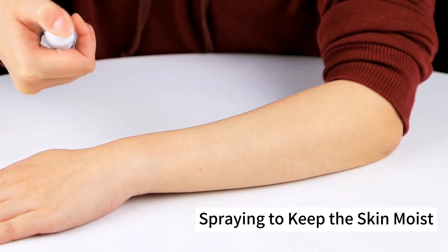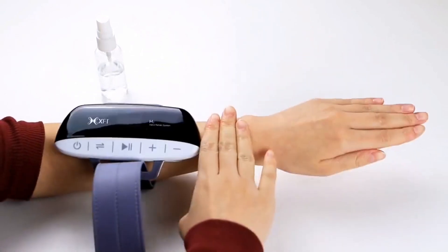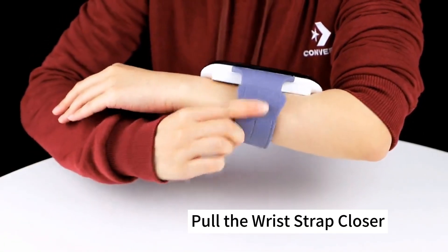Spraying to keep the skin moist. The main unit is about 3 fingers away from the wrist. Pull the wrist strap closer.